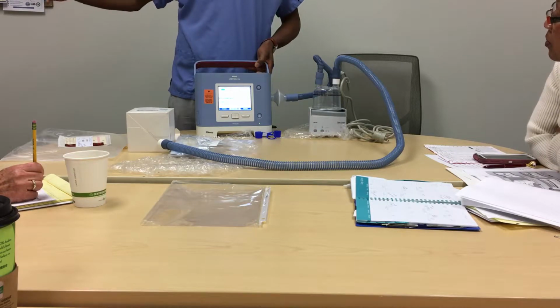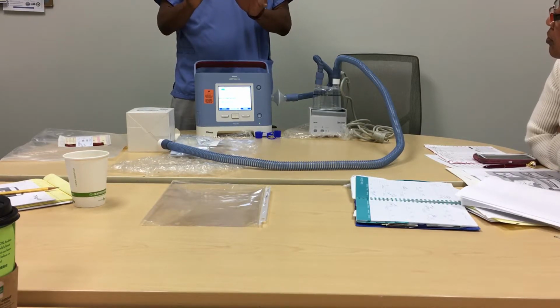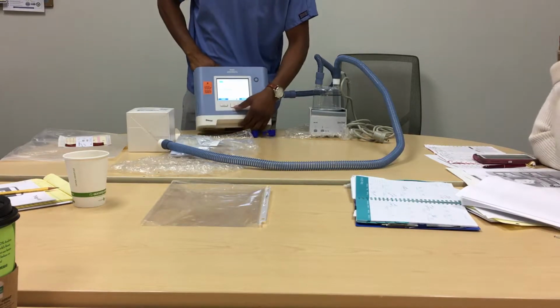Just that on the regular CPAPs, you don't have a set minimum EPAP and IPAP. On this, you could. So you have your max pressure, the rate, the minimum and max IPAPs, and the minimum and max EPAPs. With that, you could dial in the sensitivities, dial in the I-times, and other good stuff.